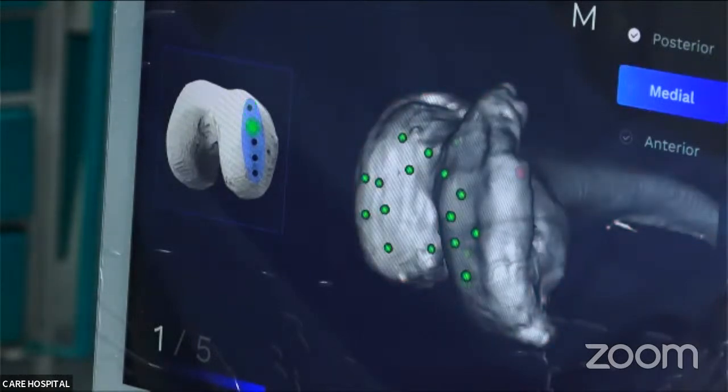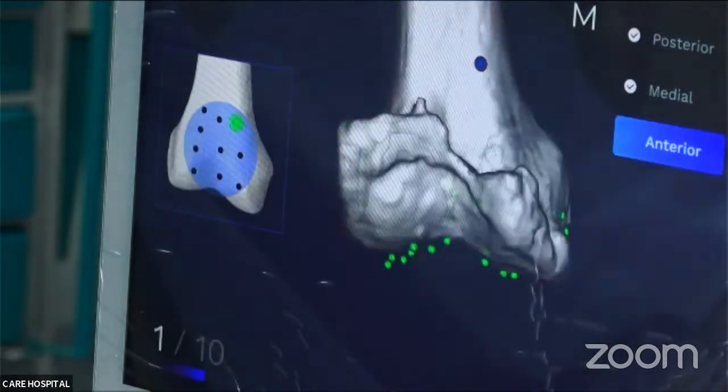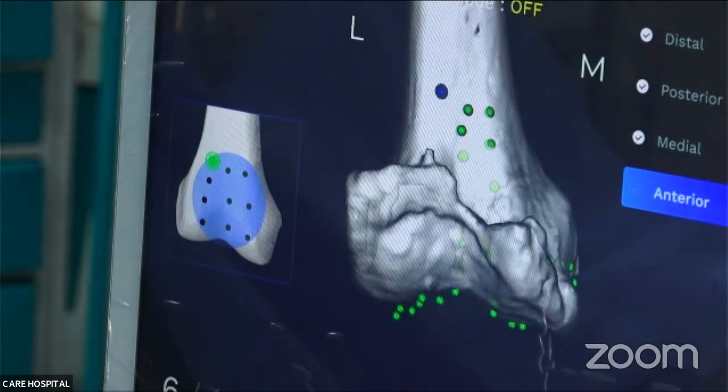That's why real time is needed. With the CT scan, we've done the virtual surgery. Now we are doing the real time with the navigation. The tracker bulbs are there, infrared rays are being emitted, and the stylus which is giving the points also has tracker bulbs.